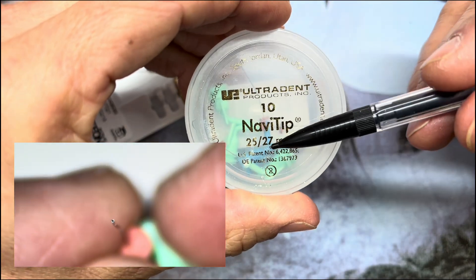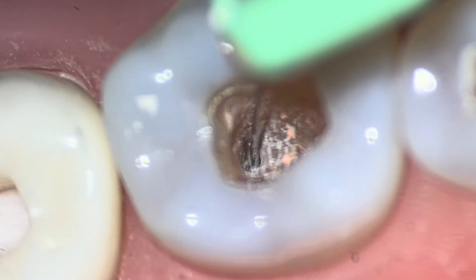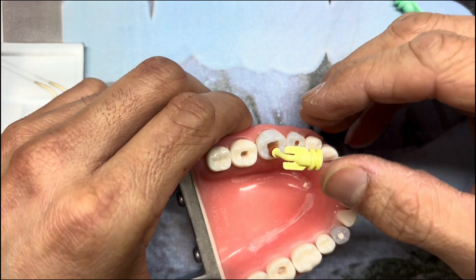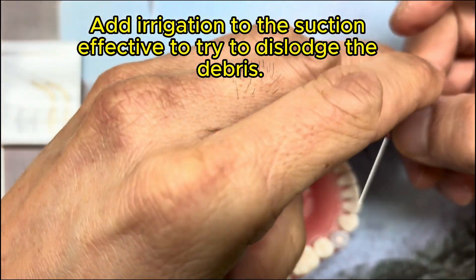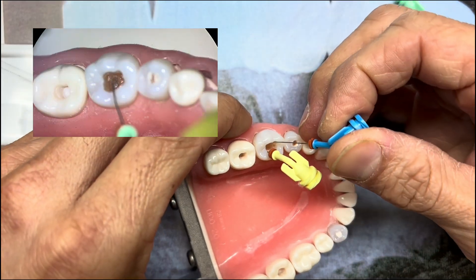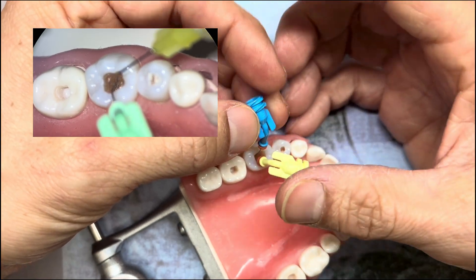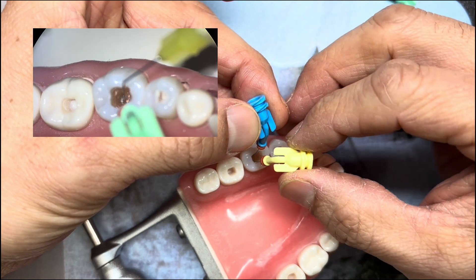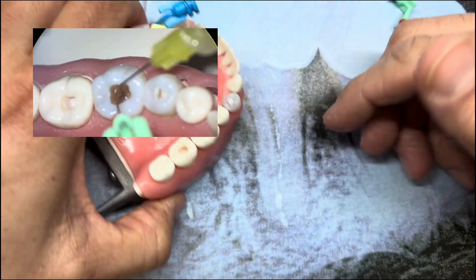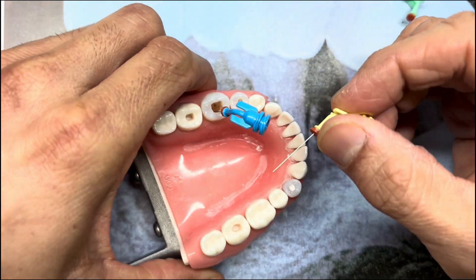They come in different gauges and different lengths — these are 30 gauge, and they are open-ended. That's going to be really tough to do, but it is possible. Another approach is to irrigate simultaneously: take EDTA or sodium hypochlorite, place your irrigant syringe, and flush the canal while using the tip to suction — flushing and suctioning at the same time, trying to get the debris into solution and pick it up.